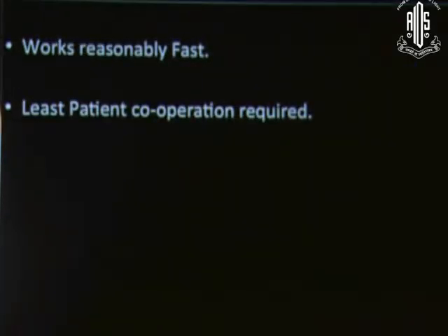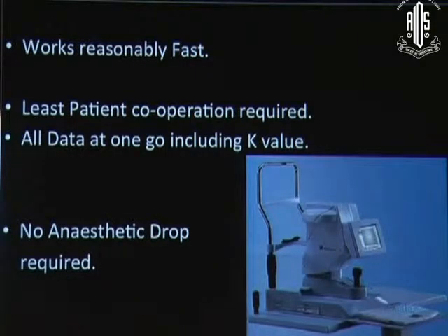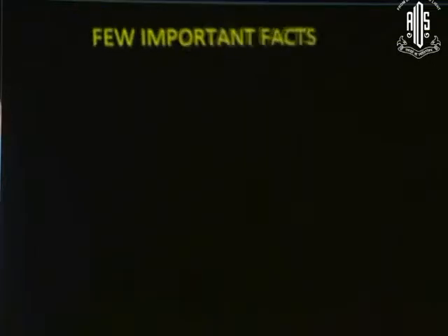So it works reasonably fast, and the cooperation of the patient is not so much. You do not require a very cooperative patient. The data go in, which includes the K value, and of course no anesthetic drops are required.